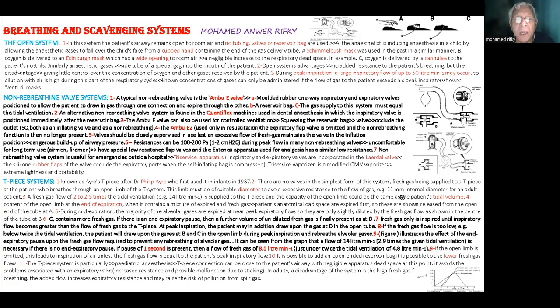This is the figure we mentioned several times before. In this system, the expiratory limb ought to have a volume not less than the tidal volume of the patient. I will show you later on how it works in a figure.